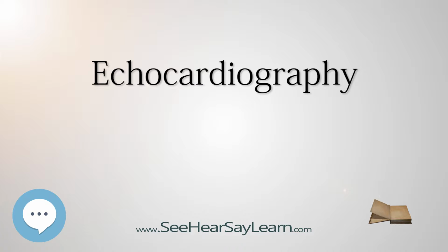Indications. Health societies recommend the use of echocardiography for initial diagnosis when a change in the patient's clinical status occurs and when new data from an echocardiogram would result in the physician changing the patient's care. Health societies do not recommend routine testing when the patient has no change in clinical status or when a physician is unlikely to change care for the patient based on the results of testing.